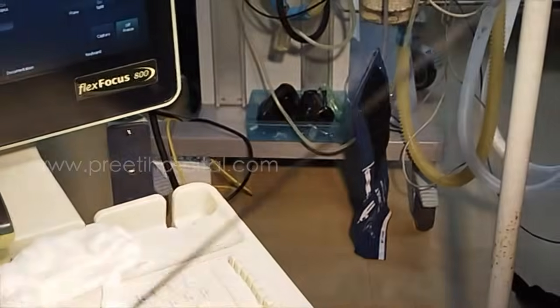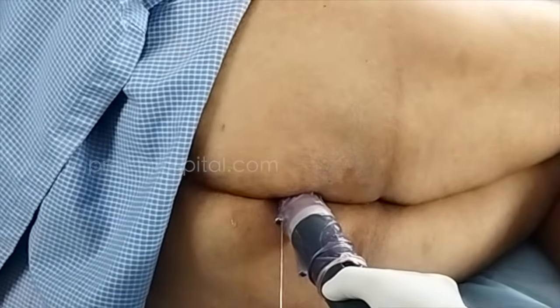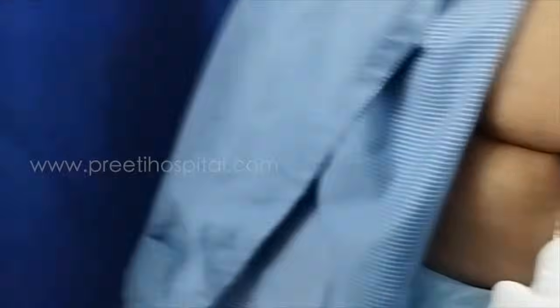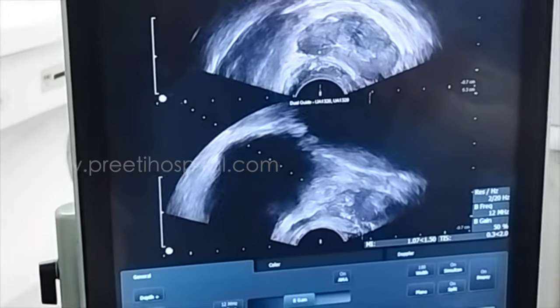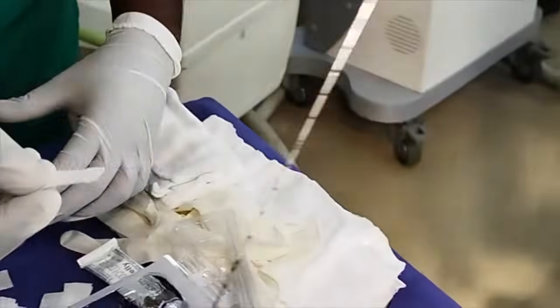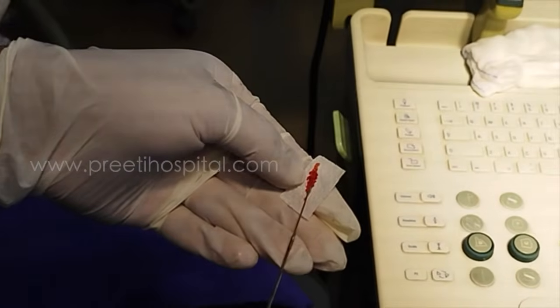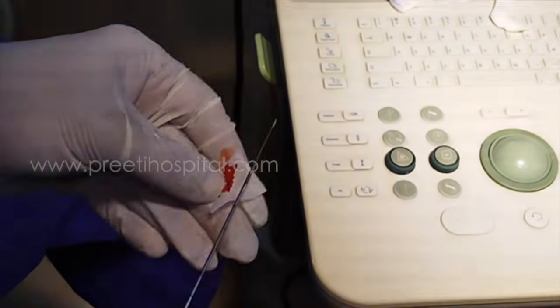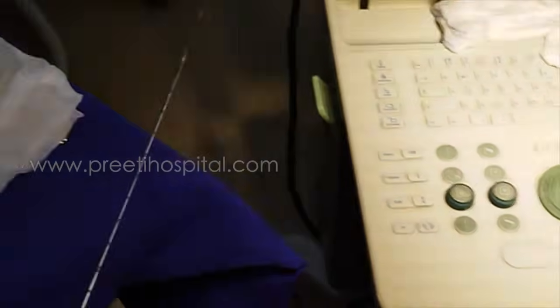Now you will take the same again medial. Medial, not too medial, because periphery will be there more. Lateral. Okay, this is okay. Not towards the urethra. Now this piece will show the 15th piece. Here blood is coming at the same time. Piece is also coming. No. Once more I will do. Once more you take it. You discard this.